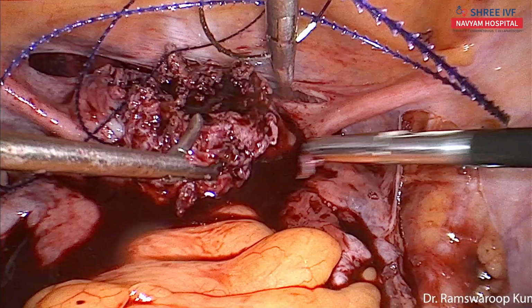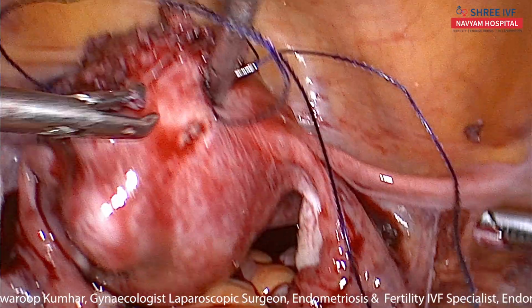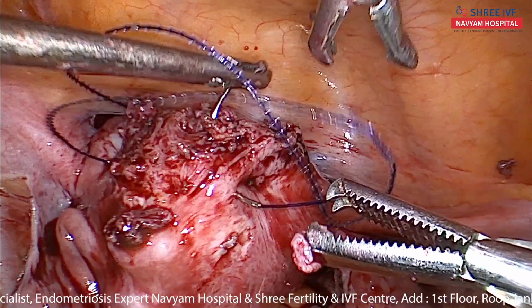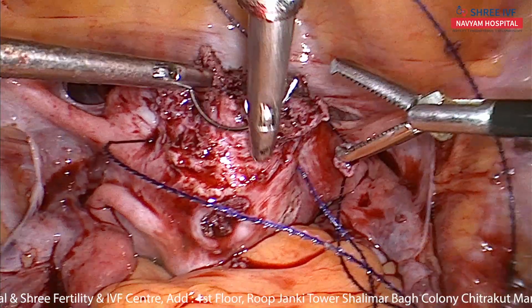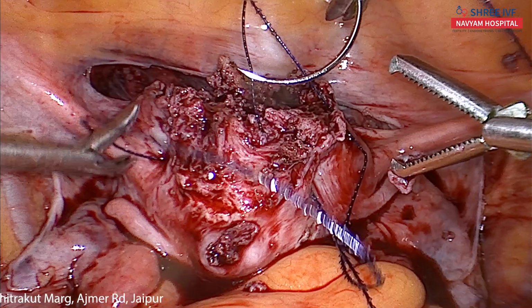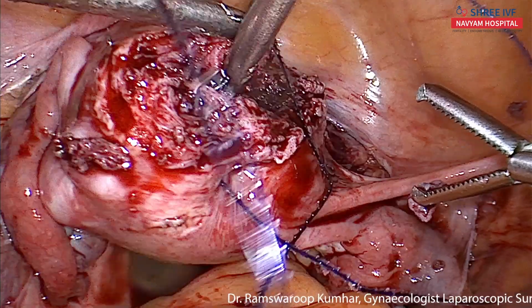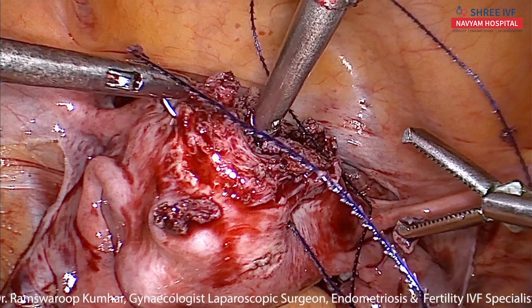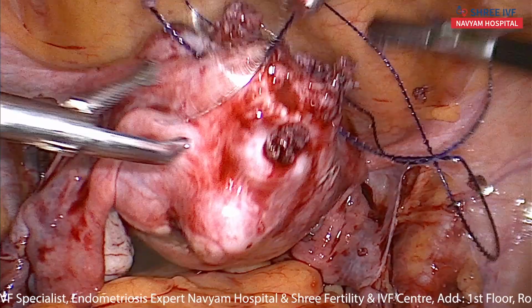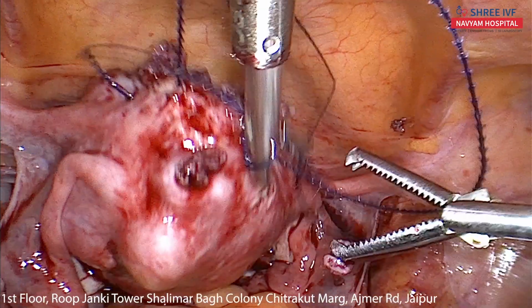No, there is no myoma. This adenomyotic tissue actually, we can suture it again here. To cover up this serosa, I have taken the suture back. Take it like this.